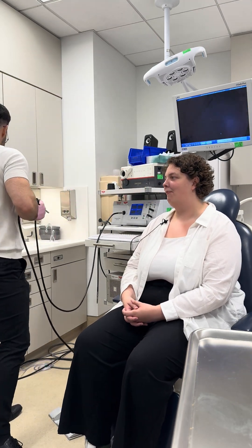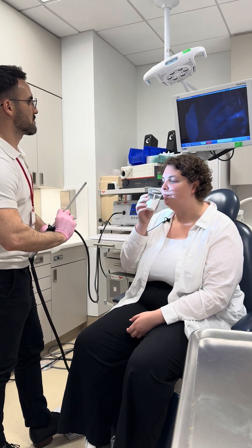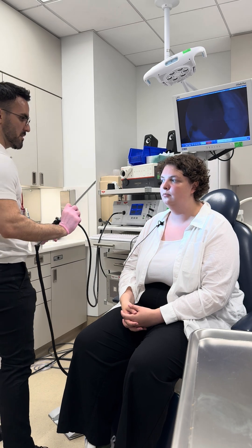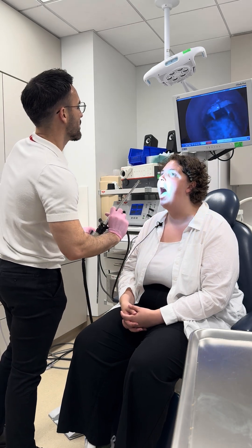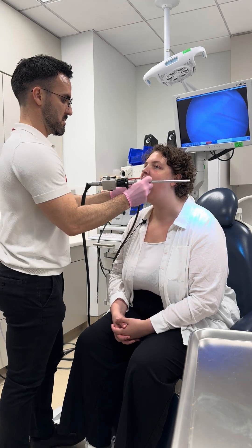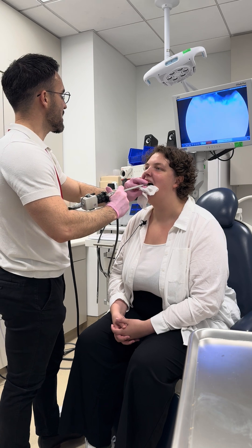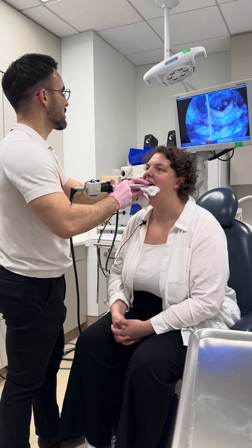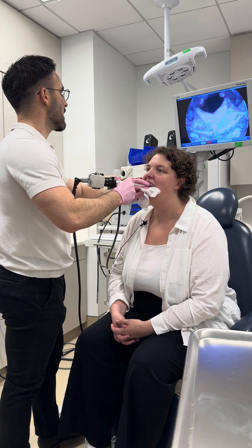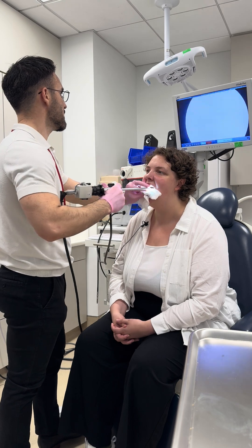Next one will be, just take one sip of water. Go ahead and open up your mouth. All right, go ahead — there you go. Chin up, smile and say eeeee. Good, and breathe. Again.